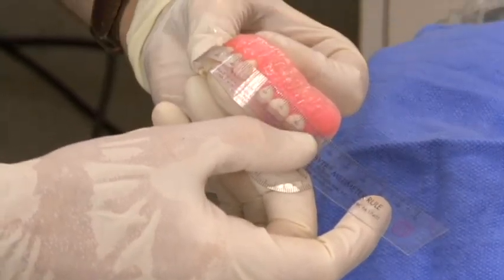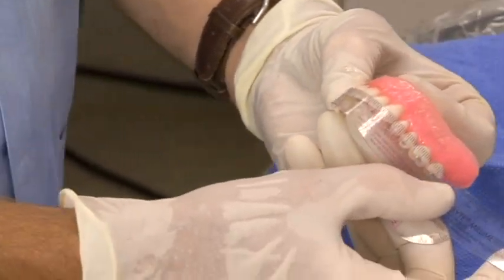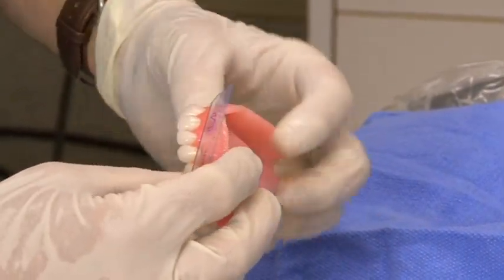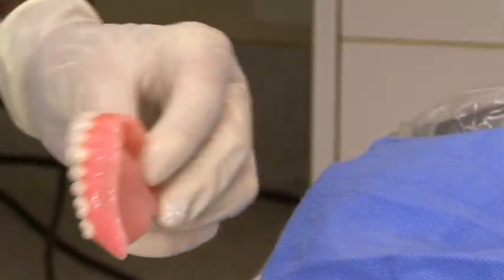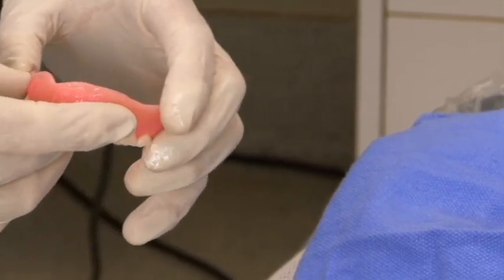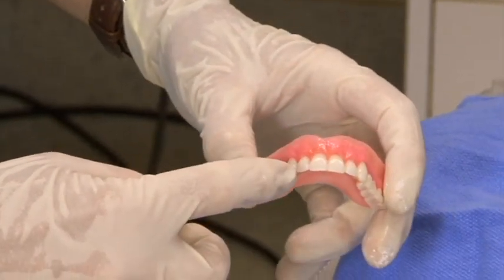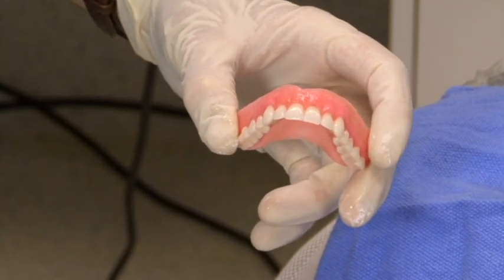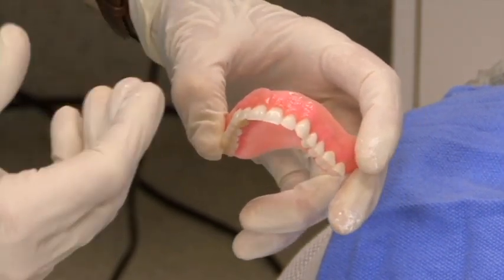If I measure the width of the six anteriors, we're right at 50, and I think our original measurement was 51. We changed out the laterals a little bit and altered the shape of them. That's one of the nice things about a Crea Pearl tooth — you can change the shape of it without losing the color.